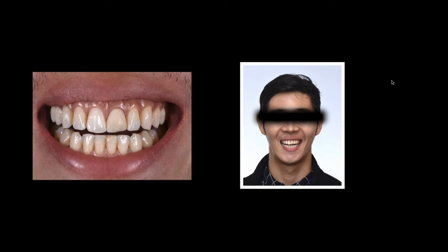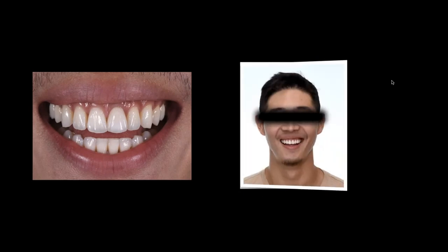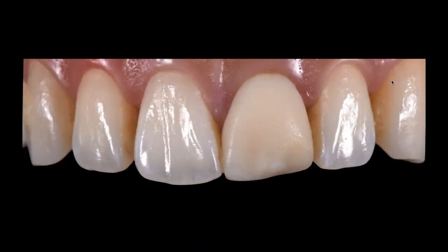I don't want the most translucent, yet I don't want the most opacified either, because I'm going to take a little bit of the warmth from that tooth and then use that to help mask what's underneath there and then do my layering concept over it. The other thing that I'm always trying to do is simplify the layering concept. So what do I mean by that? Well, I think the substructure that I choose has a really big importance on how we actually make that work. And remember, in the end, what am I looking for? The patient's face in general, not just zooming in on my work all the time. As important as that is, I want to study it and I want to understand it, but I also want to know how to get there.